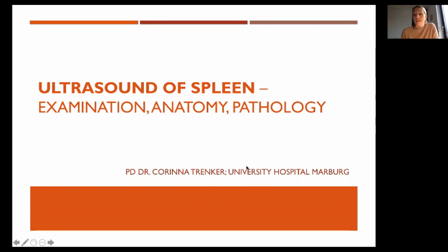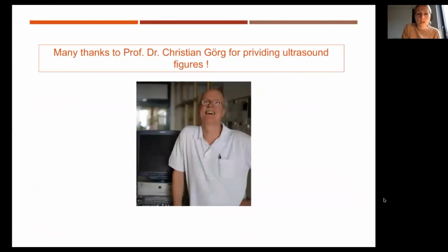Dear students, it's a pleasure for me to give this education lecture today about ultrasound of the spleen, examination, anatomy, and pathology. My name is Corinna Trenker. I'm working in the University Hospital in Marburg in the Interdisciplinary Ultrasound Center and also in the Department of Hematology and Oncology. First of all, many thanks to Professor Dr. Christian Görg. He is my teacher for many years, and he provided me some ultrasound figures for the lecture.